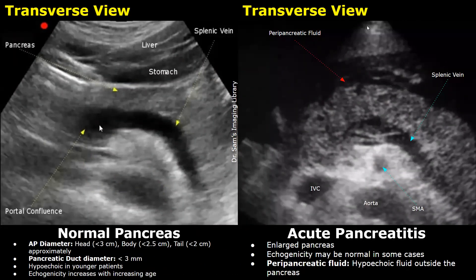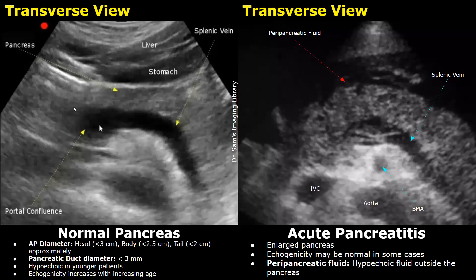We will compare the normal image of the pancreas with acute pancreatitis. The transverse plane is very helpful in imaging the pancreas. This is the normal pancreas in transverse plane — the liver can be used as a window to scan the pancreas. It has three main parts visible in transverse plane: the head, body, and tail.